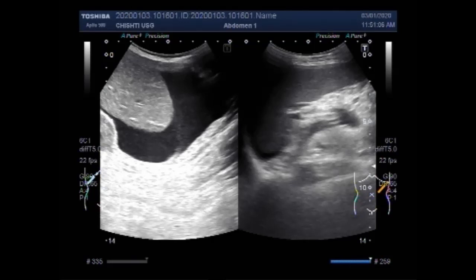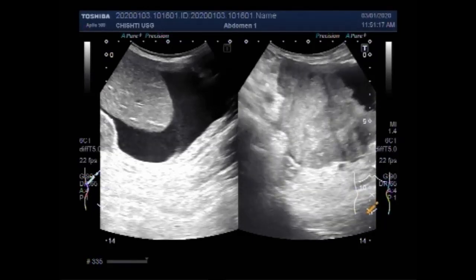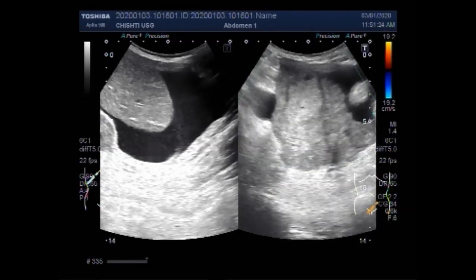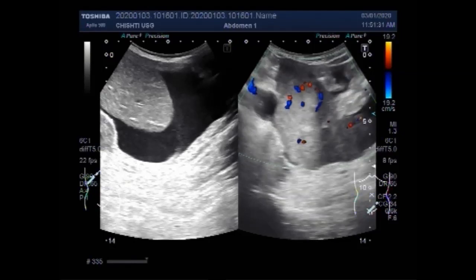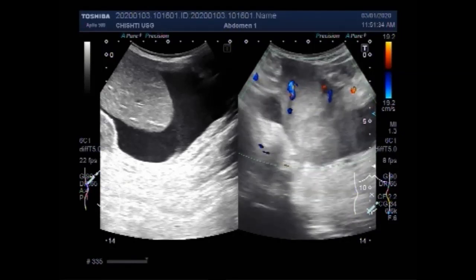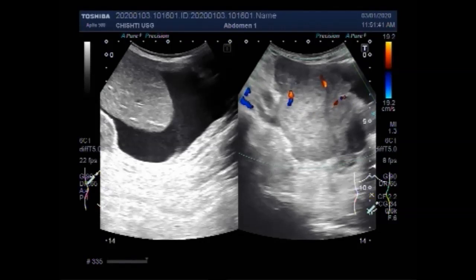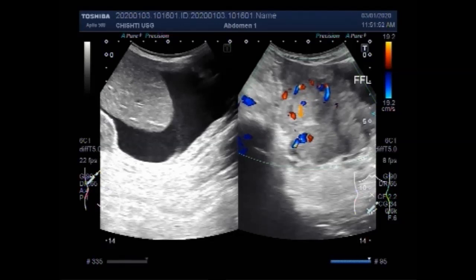Now again you are going to see the lower portion of the abdominal cavity. Free fluid is also seen here in the adjacent area of this ovarian mass, and the mass has significant blood flow. This is free fluid, and this is the left ovarian mass; this is free fluid and this is the liver.